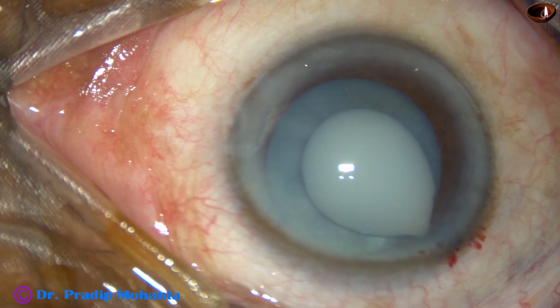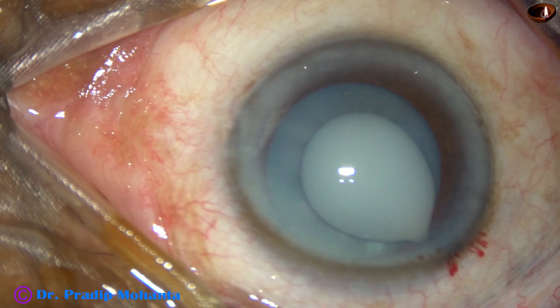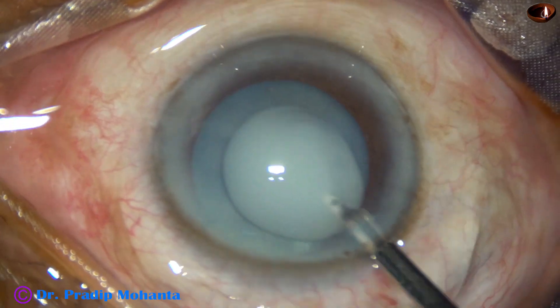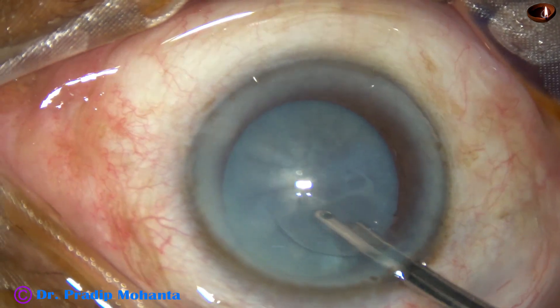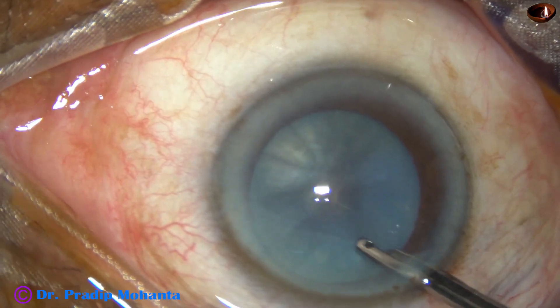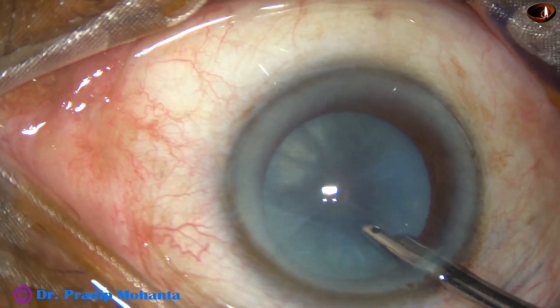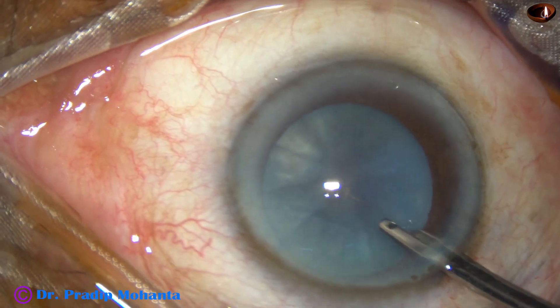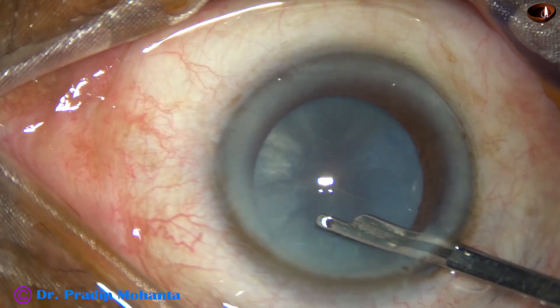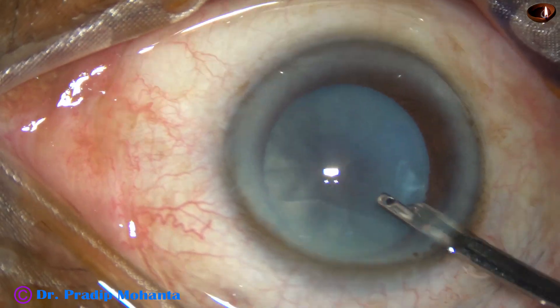After making the incisions and staining the capsule with trypan blue dye, as soon as the anterior capsule was punctured, excess milky fluid came out. The milky fluid is aspirated with a 23-gauge Simcoe cannula and the positive pressure in the intra-lenticular space is decreased.